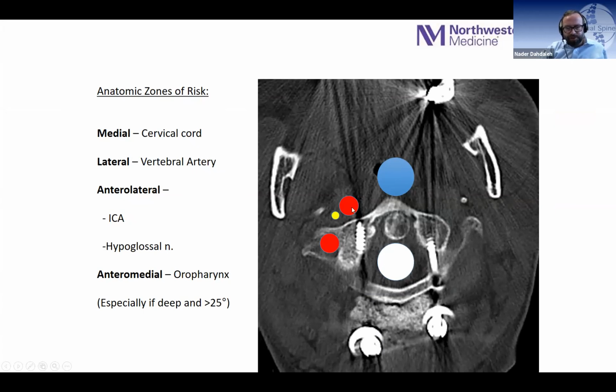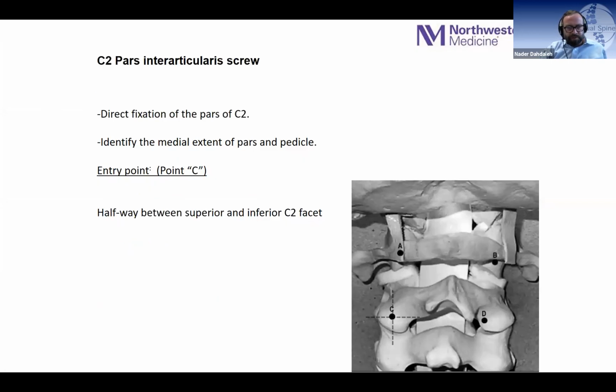You can get a carotid artery injury by putting too long of a screw bicortically. Initially, when I started doing them, I used to do bicortical and then get a post-op CT. It's like, oof, man, that's too close. Because look, with the lateral X-ray, the tip of the tubercle is so far anterior that it can fool you. So really don't get that screw long toward the level of the tubercle. You want to keep it short. You want to make sure where the lateral mass is, and you can see that on a lateral X-ray too. Now I freehand them these days, but when I use X-rays, I use a lateral view.